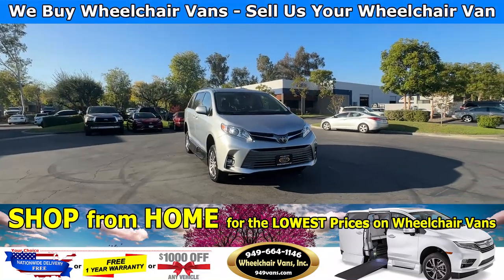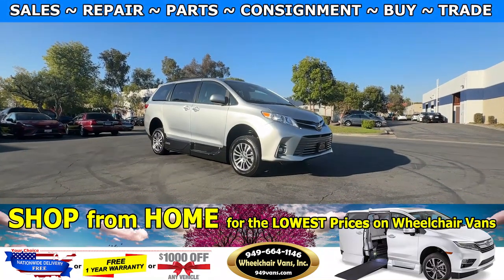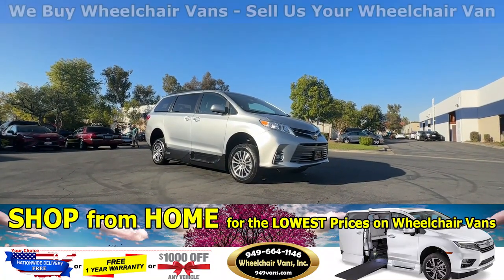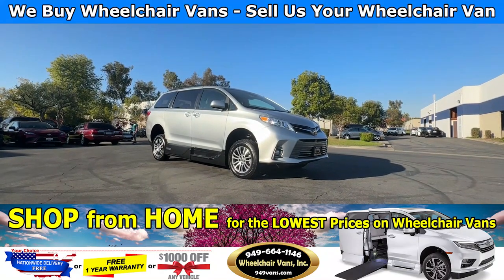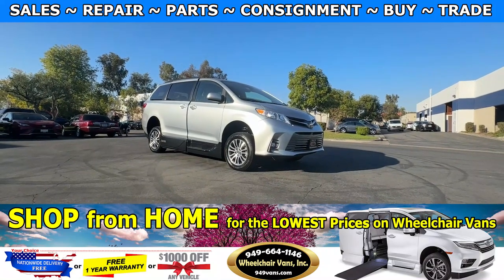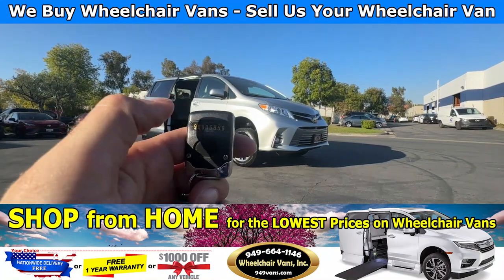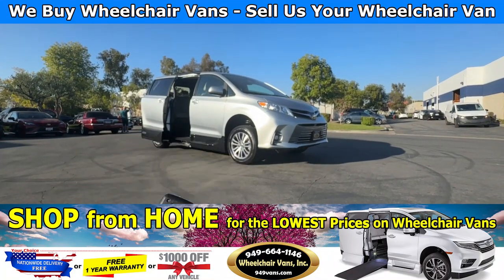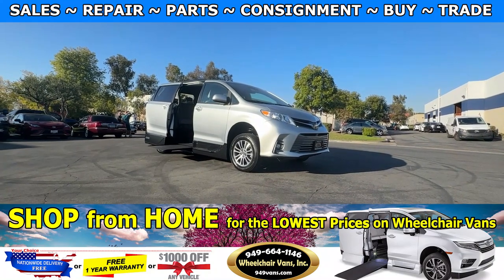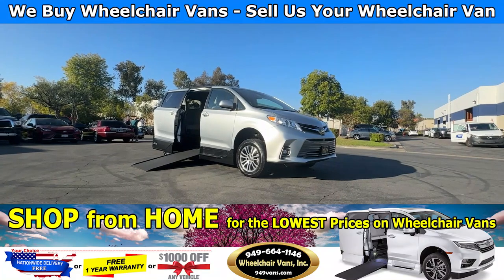Hello and welcome to Wheelchair Vans Inc. Today I'll be going over a 2019 Toyota Sienna XLE equipped with the AMS conversion by VMI. To operate the ramp, you will use your key fob to hit the sliding door button. This is going to be a two-touch system, so you'll have a separate key fob to operate the ramp. This will take out the ramp and it will also lower the vehicle.